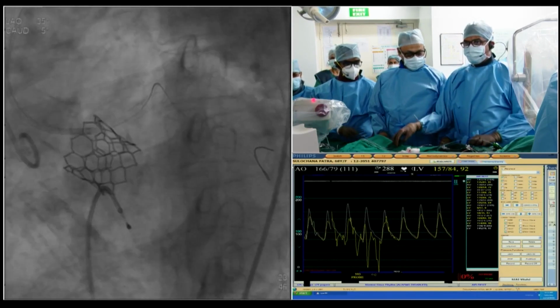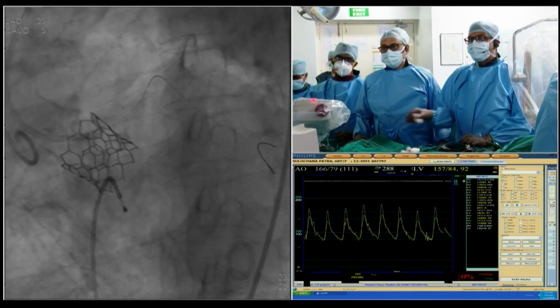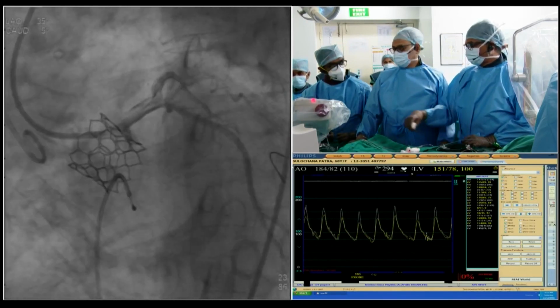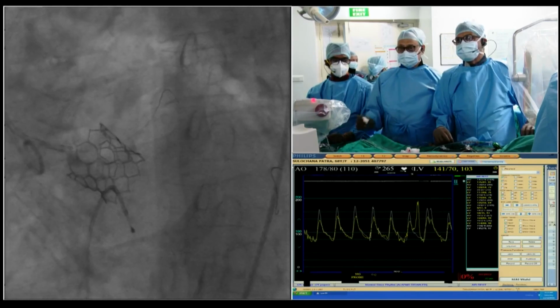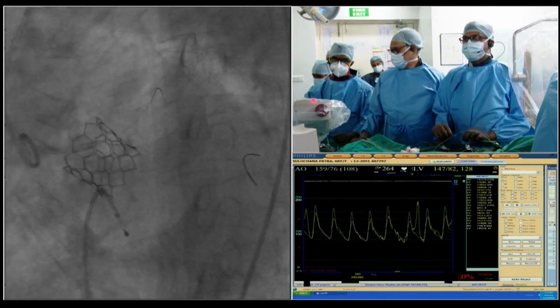I don't know whether the stent actually is inside too much into the left main, I think. We'll get a quick IVUS in, as you are saying anyway. So, is it not quick or is it? No, it takes time. It takes time. Okay. By the time the setup.